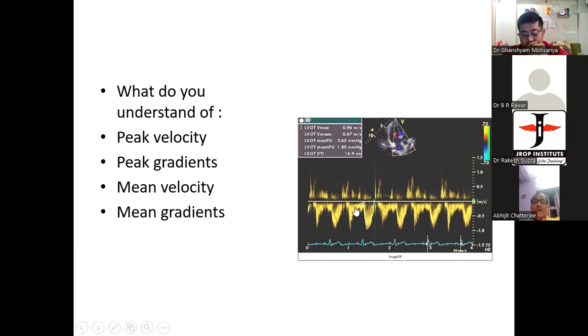Hello? Hello, can you hear me? Sir, see the fourth complex. Again, please repeat, sir. See the fourth complex from the left side. Hello? Can you hear me? You can't hear me? Yes, sir. I hear you, sir. But I can't get your question actually. Can you see the picture? 1, 2, 3, 4.